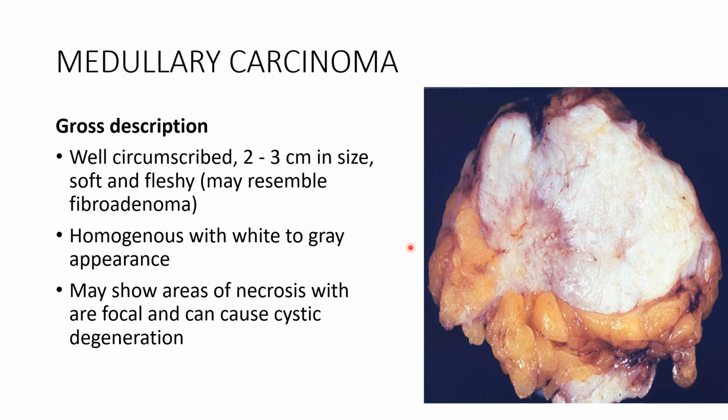Grossly, you may appreciate a well-circumscribed area, but there are areas of necrosis and cystic degeneration.